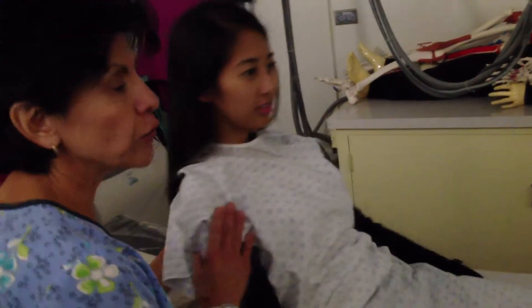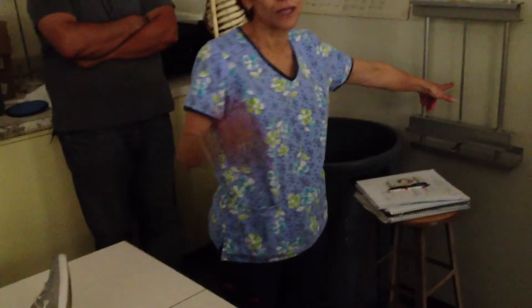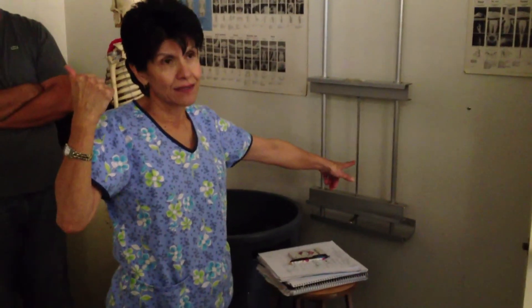That's one way. The other way is I can keep her on her gurney — and sometimes they do this in MED. I'll bring in the gurney here, and I'll sit her at the edge of the gurney, but I still need to find out: can you sit up? Are you okay? Keep your eyes open, don't close your eyes, take some breaths. Because if you do it this way... What's your name?